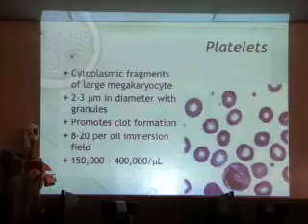They should have granules. On the right stain, you should be able to find small, tiny purplish granules inside the platelets, and that's very essential. They contain materials needed for platelets to function, as in plugging up damaged blood vessels or activating the clotting factors, making sure that the clot actually begins when it's supposed to. Without that, the platelets won't work, so the patient will continue to bleed.